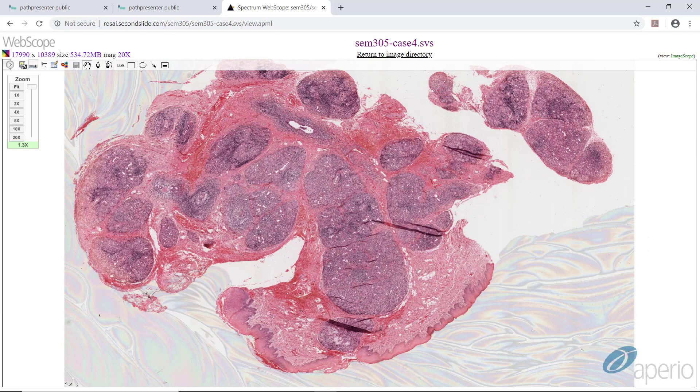Case two is Sjogren's syndrome. At this power, you can see there is a mucosal surface right here. This is non-keratinizing stratified squamous epithelium, which is the normal epithelium for the inside of the lower lip. The rest of this biopsy is composed of salivary gland. Even at low power, you can see there is a lot of inflammation in the salivary gland tissue.